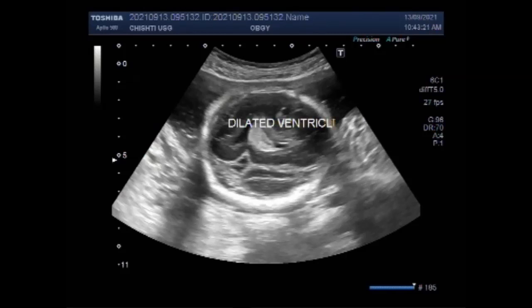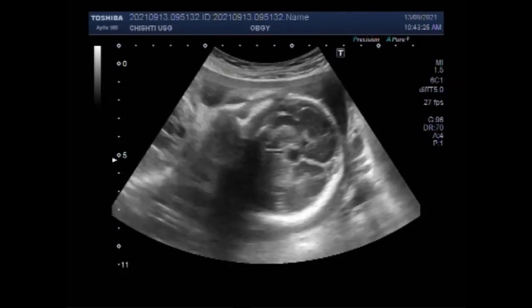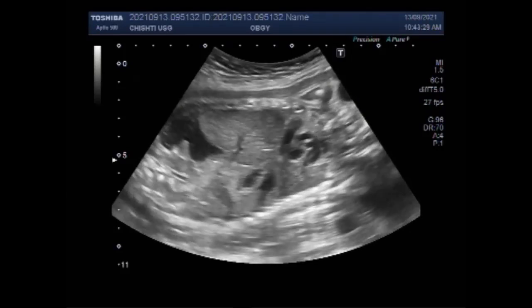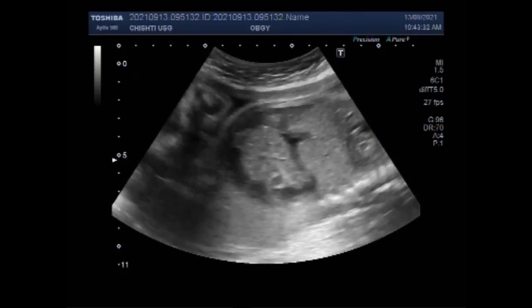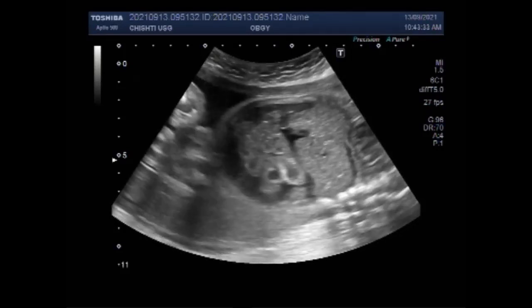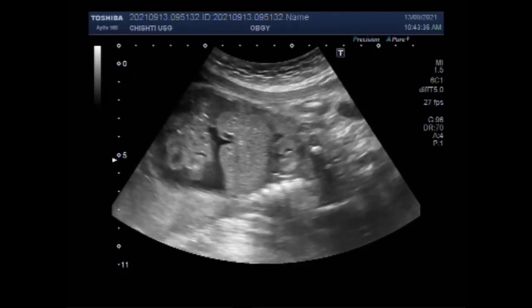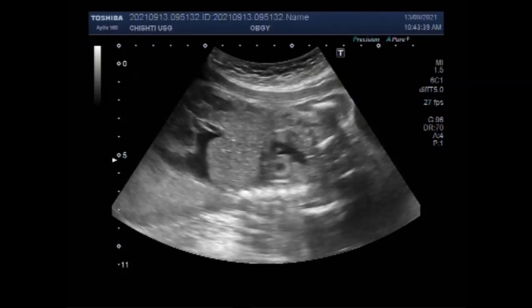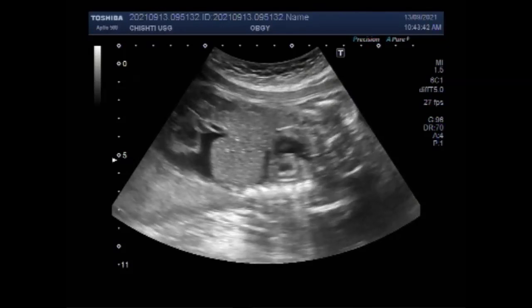There is fetal ascites, fetal hydronephrosis, and pericardial effusion. You can see the fetal abdomen and the liver. Now you can see the fetal cardiac activity, and pericardial effusion is visible.